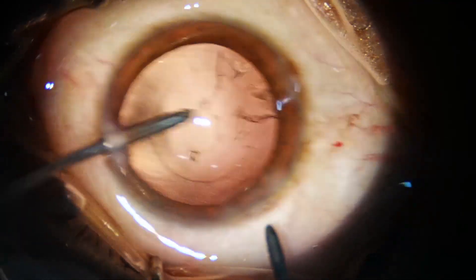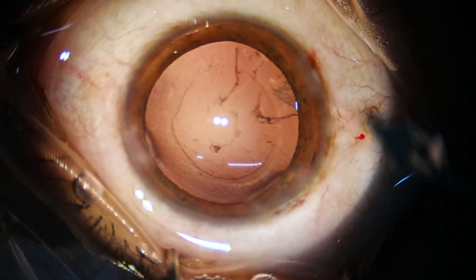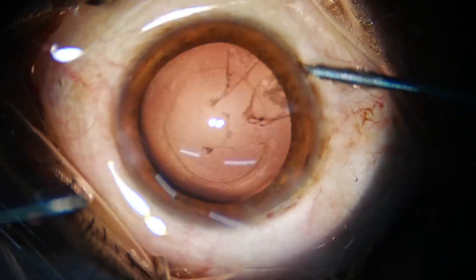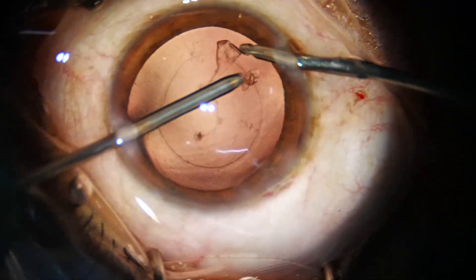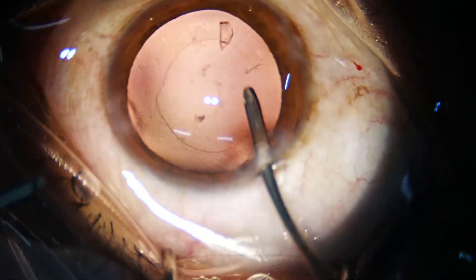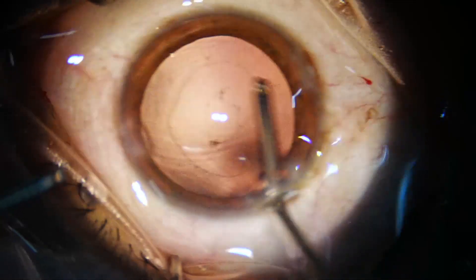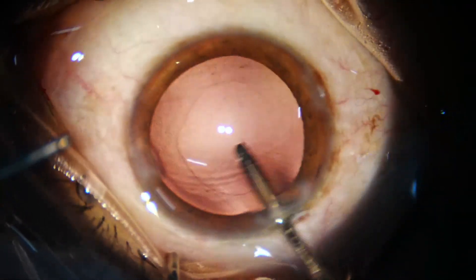There is some cortex remaining, so we take again the irrigation on the right and aspiration on the left, and remove this sub-incisional cortex — that is, the cortex just under the right side port. Now just by irrigation we can displace the cells that stick on the posterior capsule.